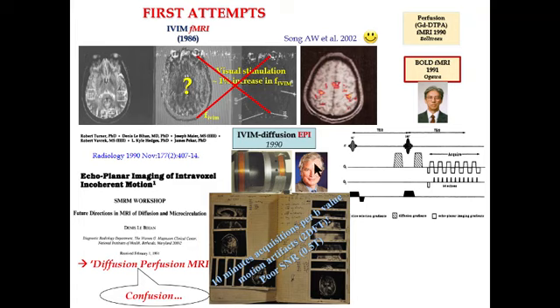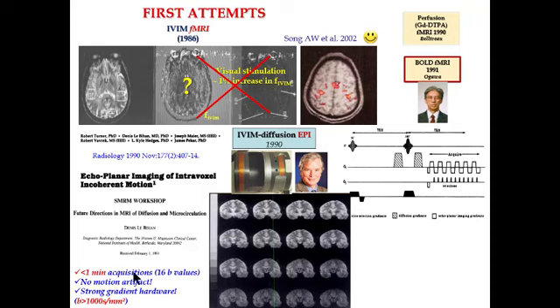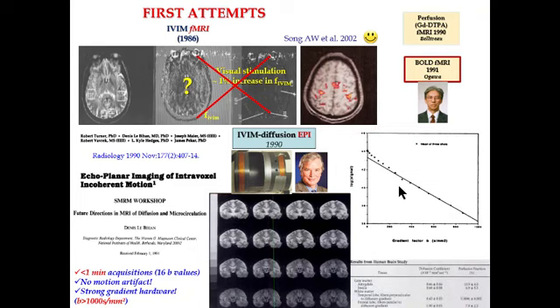And Bob Turner, who I met at NIH, changed completely the story because together we developed this IVIM EPI sequence. So we could get images now in just a fraction of time, free of motion artifacts. So we could get many slices. In 1 minute, you could get 16 b-values in one slice, or you can get several slices. The b-values also were getting stronger because of the gradient system he provided. And we could see very well this IVIM effect now in normal volunteers. And you can see that we could estimate f IVIM.